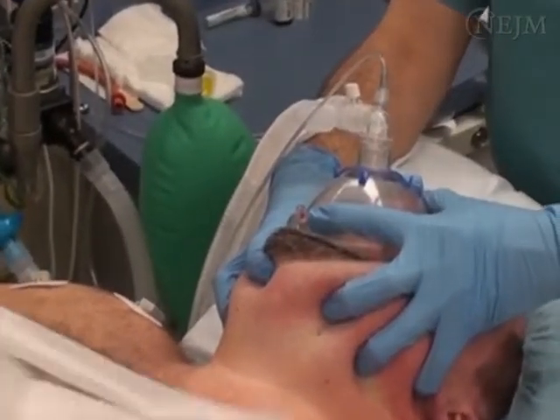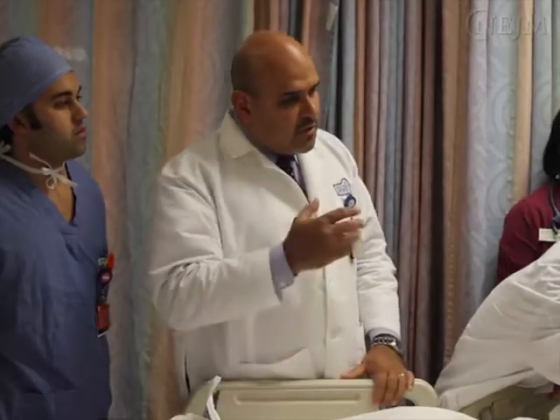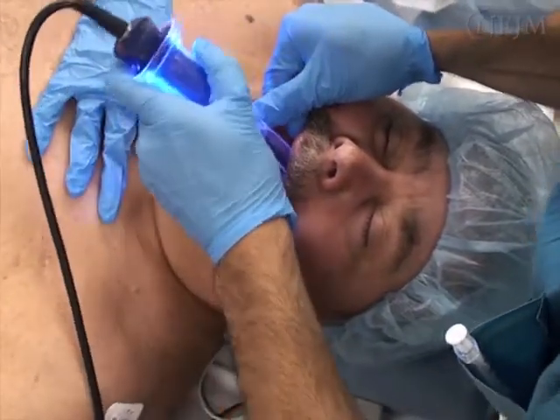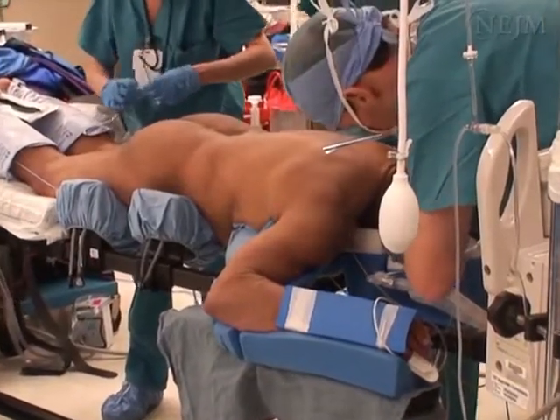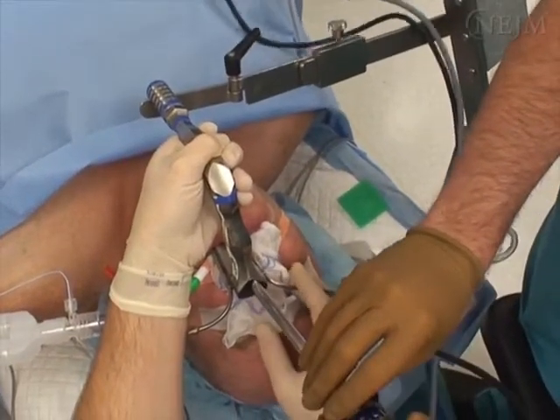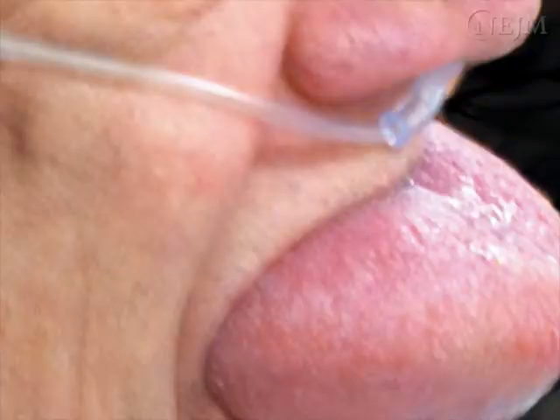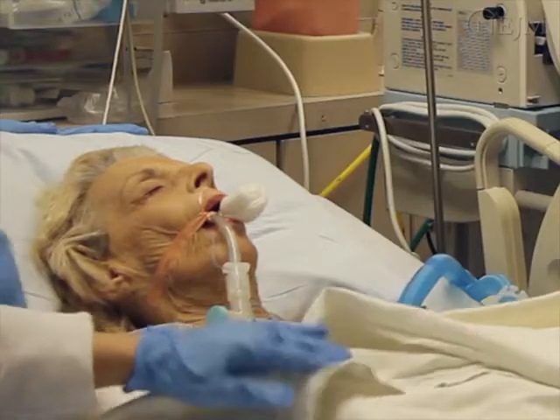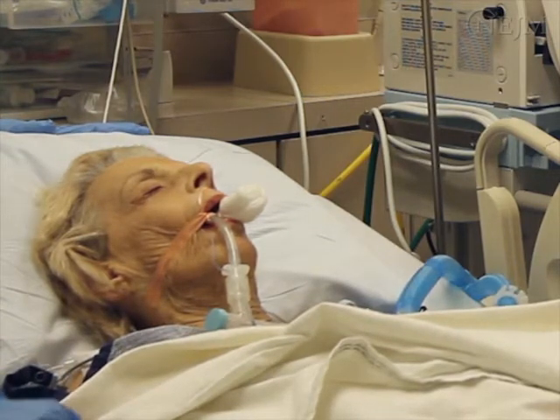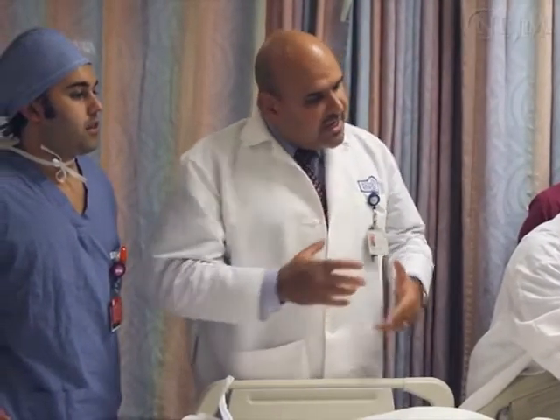When you have had difficulty in ventilating a patient through a face mask or intubating a patient, special consideration is required prior to extubation, because the management of a failed extubation can be extremely challenging. Surgical factors, such as the need for a patient to spend a long time in the prone position or the need for direct surgical manipulation of the airway, and medical factors such as angioedema, may increase the difficulty of airway ventilation or intubation. If continued intubation is deemed safer, adequate sedation and cardiopulmonary monitoring should be maintained. Document the plan and communicate it clearly to the patient's medical team.